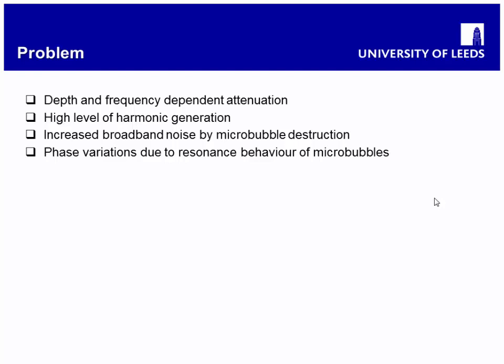So I tried to apply chirps to microbubbles as well. And it's the worst case scenario so far I've encountered with chirps. Why? Because you have depth and frequency dependent attenuation. I mean, you have this for all ultrasound imaging modalities, but microbubbles increase the attenuation. Also, the nonlinearity caused by the microbubbles increase the harmonic levels as well.